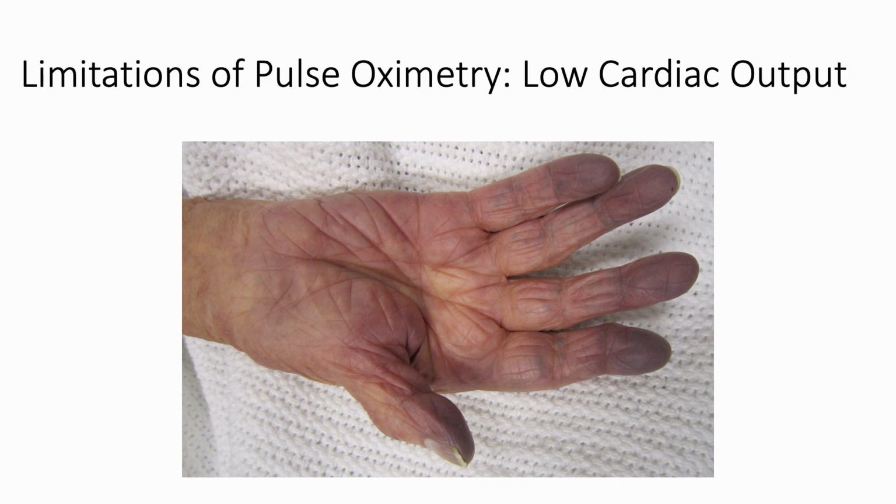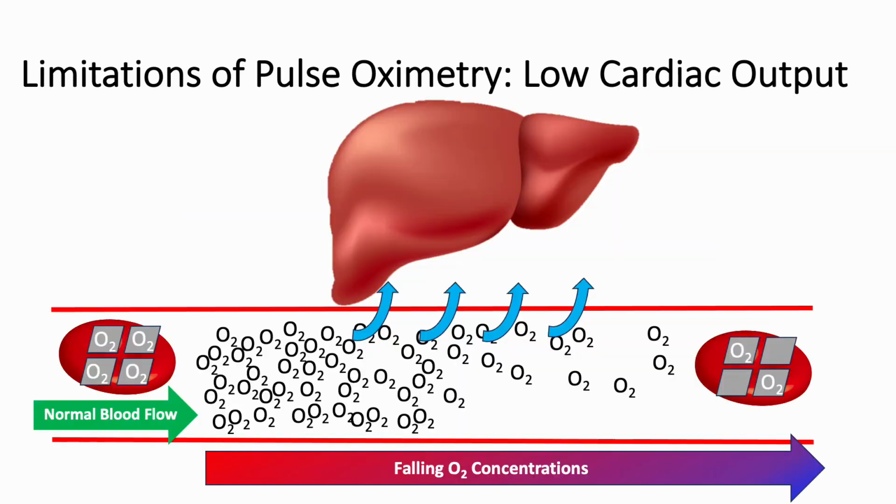Important to remember is that, much like in the case of severe anemia, even if we were able to register an oxygen saturation that appeared adequate, this might not be telling the entire story. Again, because the pulse oximeter can only measure oxygen saturation of hemoglobin, it is unable to inform us of issues with circulation that impact the transport of the oxygenated hemoglobin around the body.